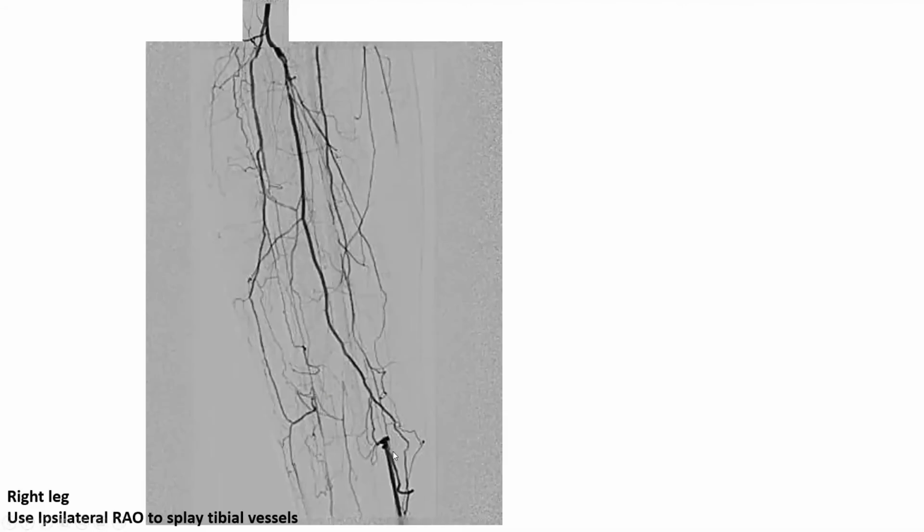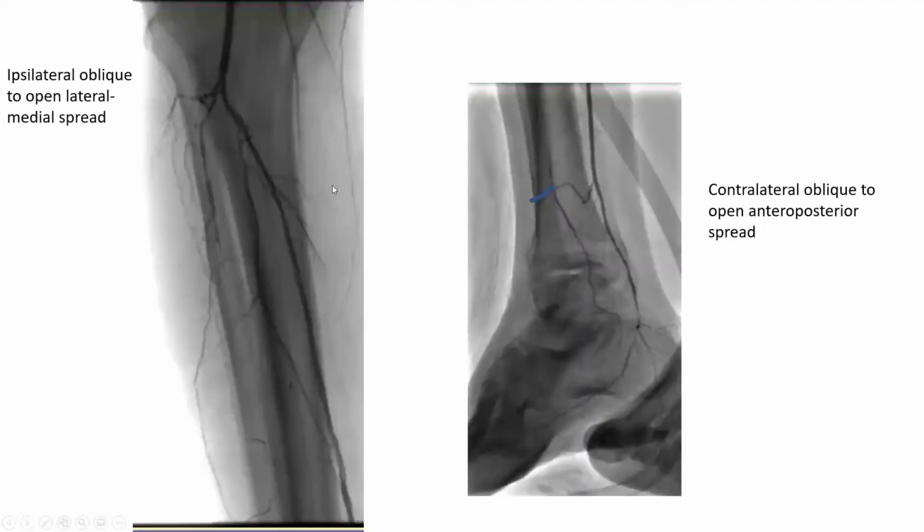This patient has a PT reconstitution, and he has actually an AT reconstitution that is less robust. Okay, this is the AT. It occludes somewhere here and it reconstitutes. PT is hard to tell where it occludes. You need more images here, and you see where it reconstitutes.